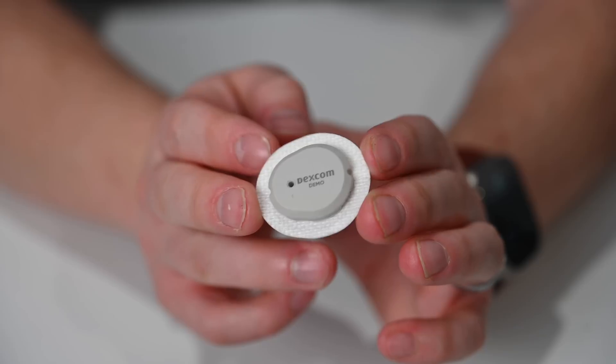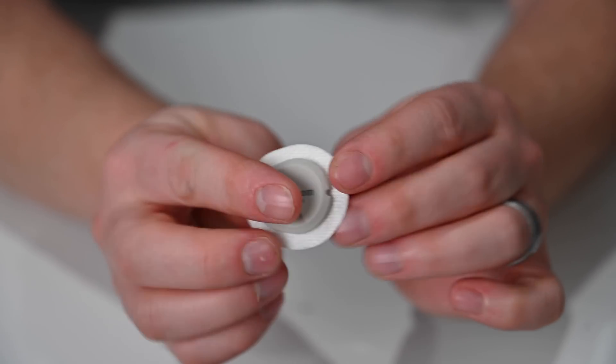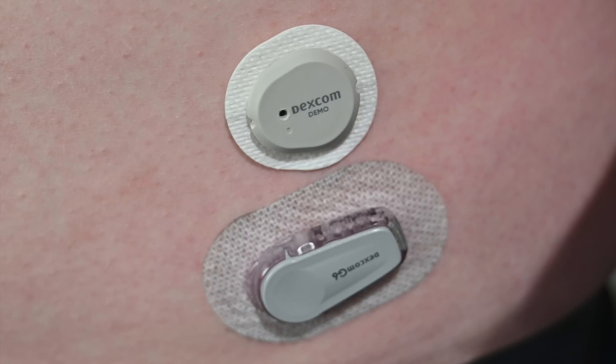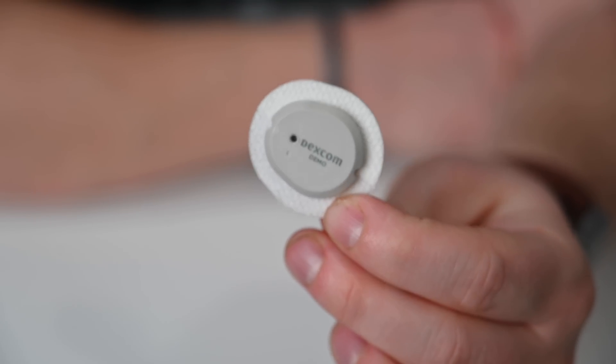With the G6, you actually had a two-part design. There was the transmitter itself that would last for quite a while, and then you had the insertion piece with the sensor that went into your body. You would throw away the sensors each time and reuse the transmitter — that's no longer the case. Once the G6 is inside its holster or transmitter housing, it is much larger. If you look at my stomach where I have this placed right now, the G6 is significantly larger than the G7. The G7 also has a soft-touch finish — almost like a rubbery feel — whereas the G6 is all solid plastic.